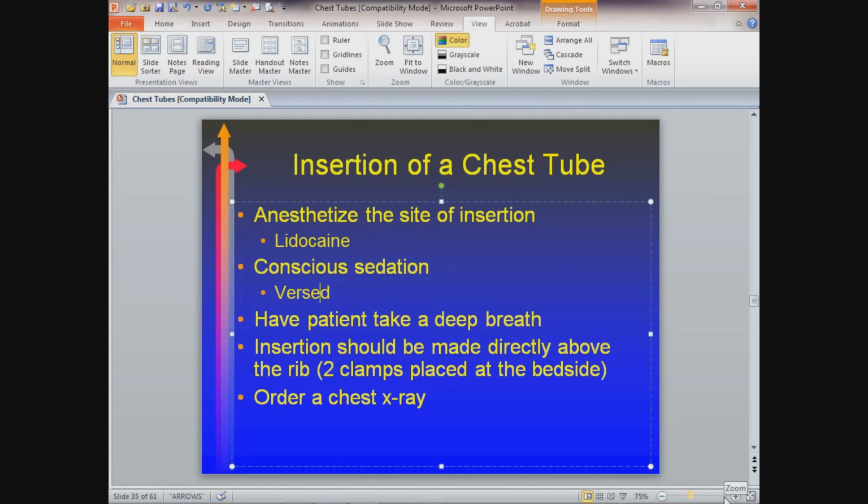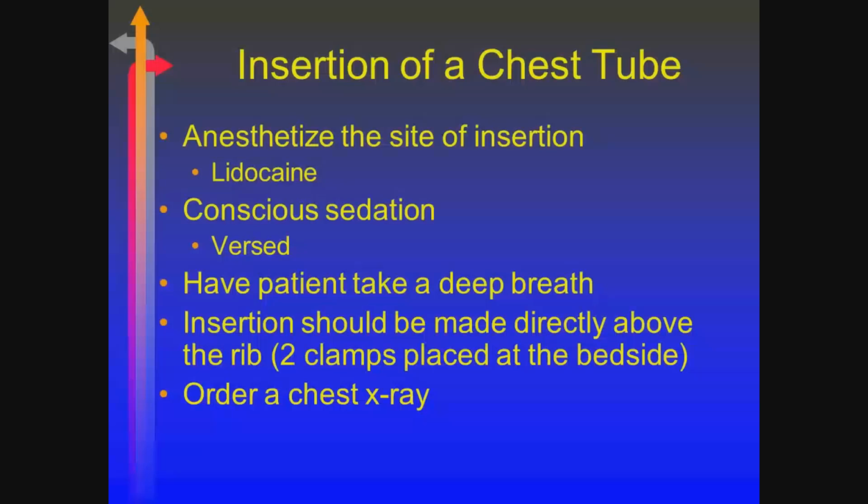And while they're puncturing into the intrapleural space, taking a deep breath will allow for a better insertion process. We know about how it's inserted, and then we get a chest X-ray once it's done.